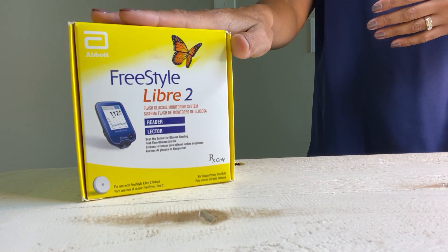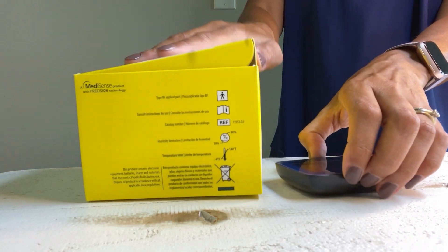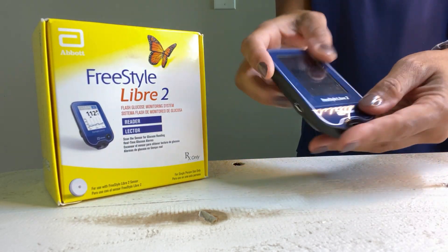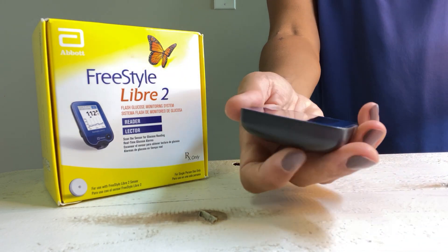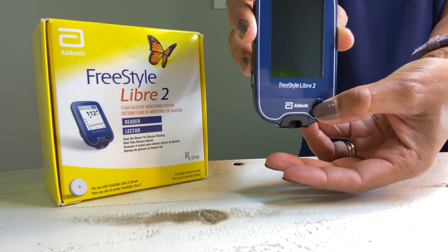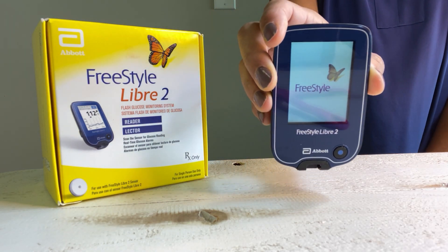First things first, you need to set up your reader. I already took it out of the box yesterday and charged it. It does come with a charger, so it's fully charged. So this is the reader — let's take off the plastic film. First things first, I want to simply start it up. You do that by clicking the button at the bottom, and you can see it's starting up.